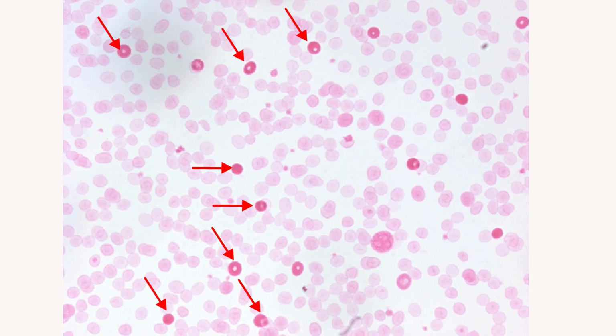Once you're done staining, examine the slides microscopically using the oil immersion objective for the presence of hemoglobin F. Red cells containing large amounts of hemoglobin F will stain a deep pink. Again, as I've mentioned, those that are pointed out by the red arrow are the fetal cells. The intensity of the pink staining is directly proportional to the concentration of hemoglobin F. Cells containing normal amounts, or less than 2%, of hemoglobin F will stain as very pale ghost cells.